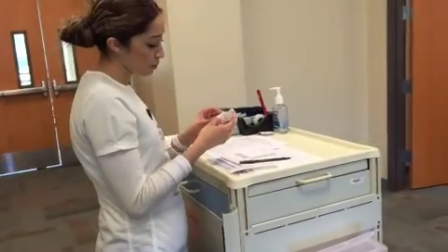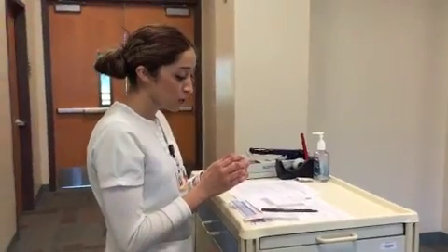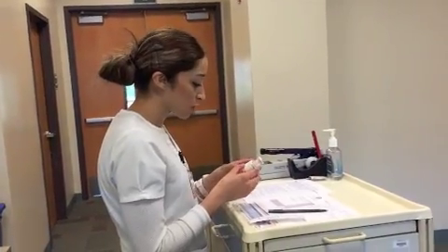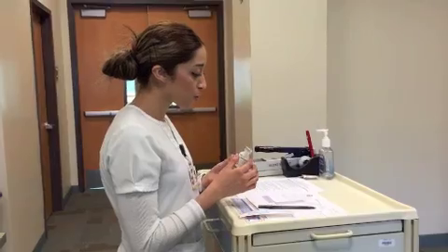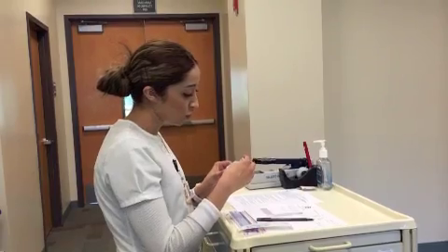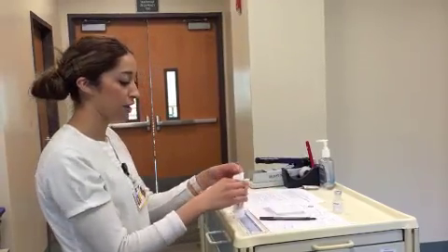And then you get your PPD solution, so you just make sure that it is a PPD solution. You check the expiration date and make sure it's for the right patient. So once again, this is Smith, Clara, and it's the PPD, and it's going to be 0.1 milliliters. And we're going to give it intradermal, and the time will be right now when I get it prepared.